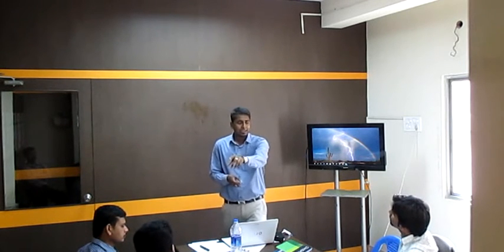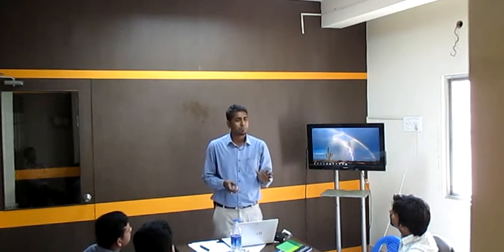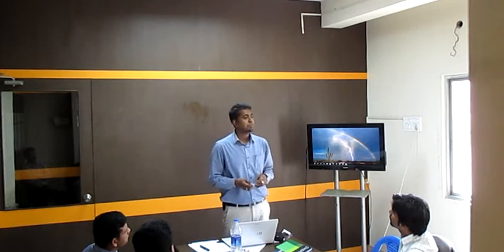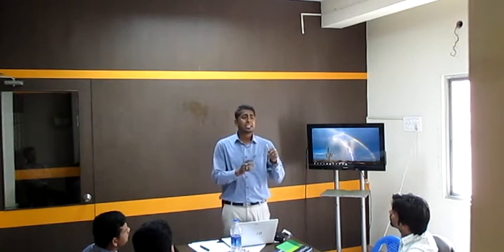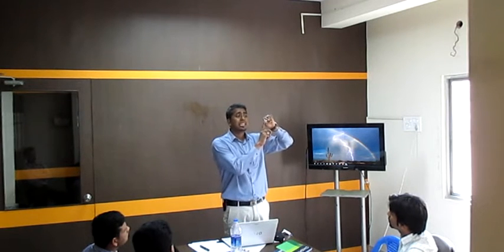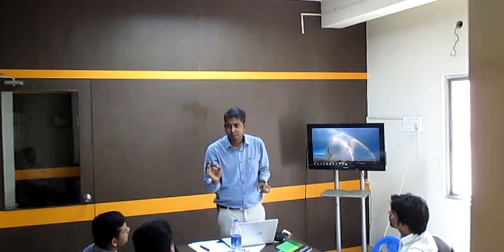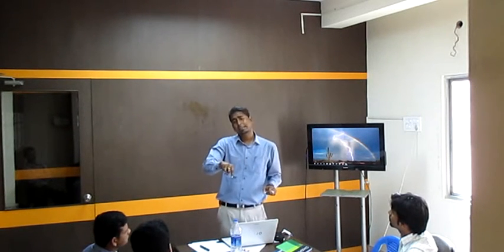He is having a very good question, what is handpiece power? Sometimes 18 watt, 16 watt, 22 watt, 30 watt handpieces are coming. What is that power? That power is nothing but the maximum power which is available with the burr to do the task. It is calculated in terms of watt.